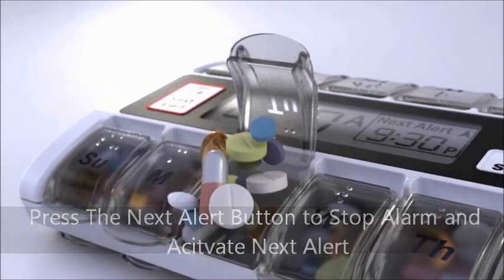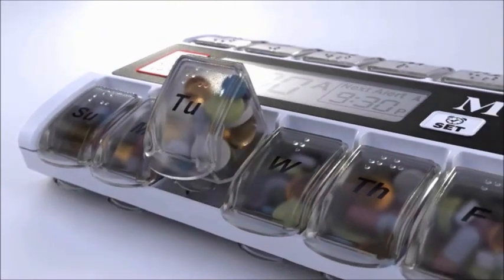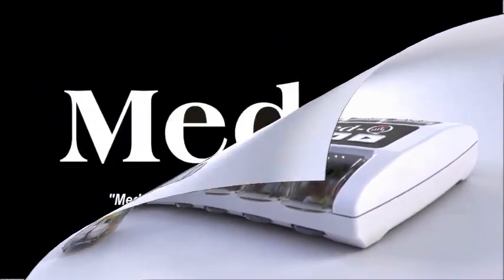Open the flashing box and take your pills with a simple scoop or remove and pour them into your hand. MedQ couldn't make it any easier.